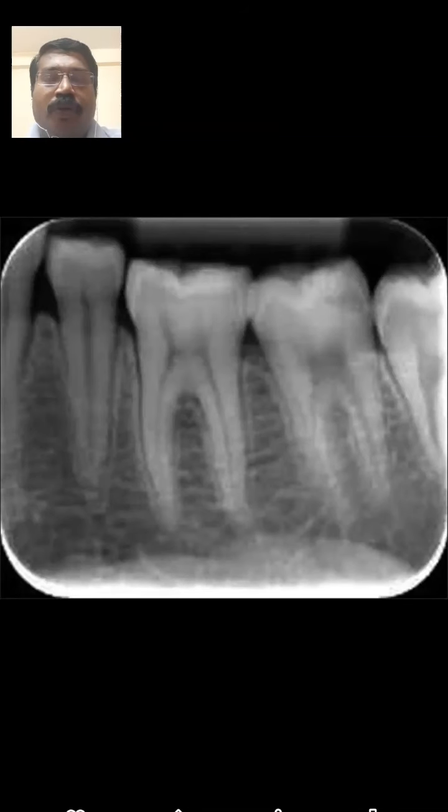We should be able to see the entire radiograph. We should note the changes in the entire radiograph. We should not concentrate only on that area of interest where we expect to see the pathology. We should see the entire area of the radiograph in detail in coming to a radiological diagnosis.